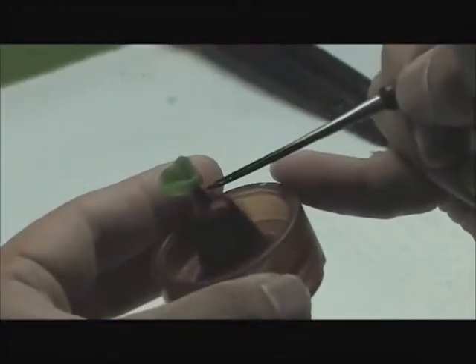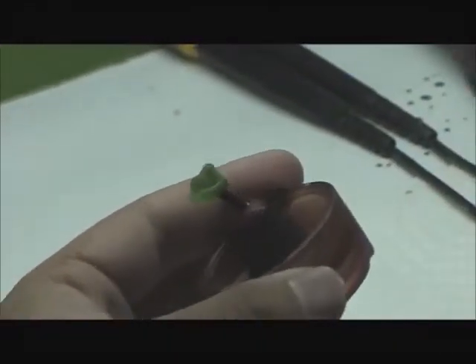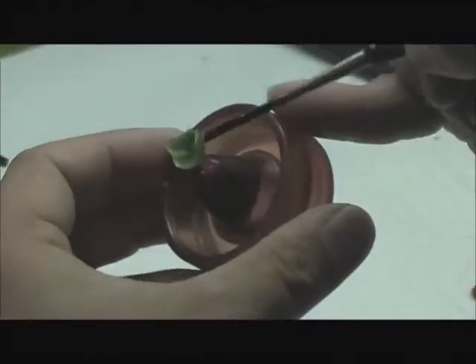Before investing, the ring with its contents is de-bubbleized with a wetting agent and dried with an air gun to reduce surface tension and prevent porosity.